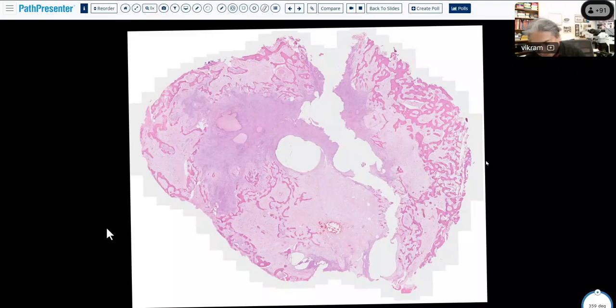That's one, which is sort of contrary to what I said earlier, but we can clarify this a little later. But the other thing is, when you initially look at the slide, and that's a very good diagnosis, Shrishma, you should look at it unbiased.